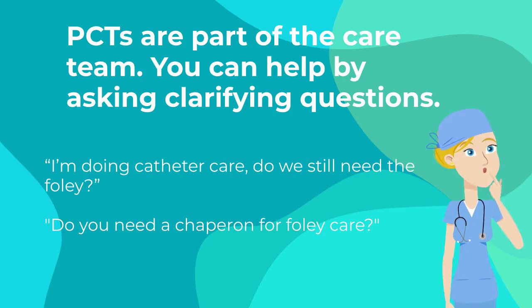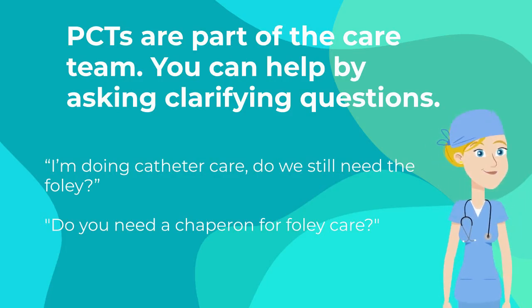PCTs are part of the care team and can help by asking clarifying questions like, I'm doing catheter care, do we still need the Foley? Or do you need a chaperone for Foley care?